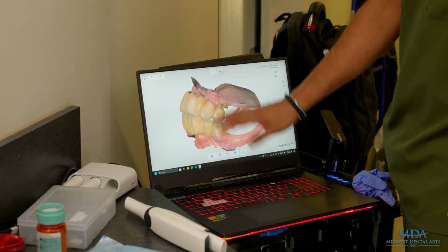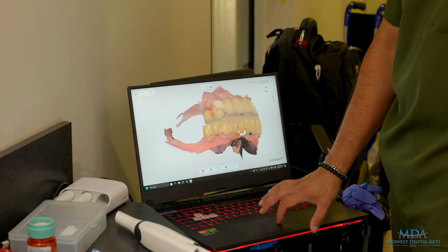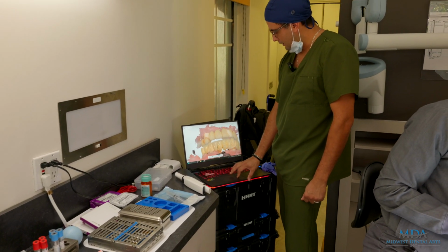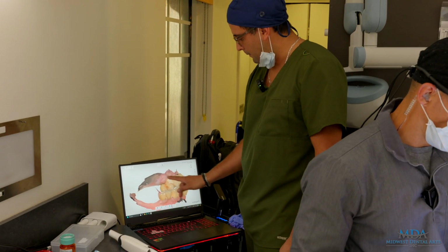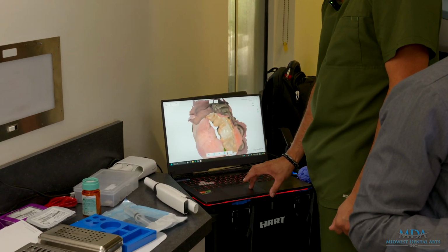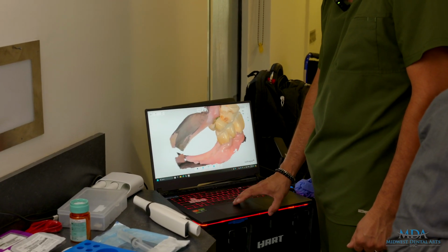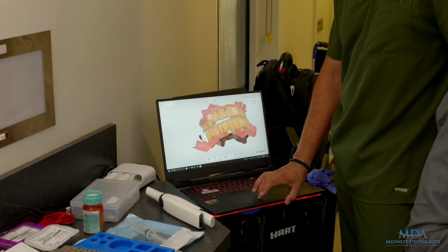And this is the tissue scans that we gathered. The bite, we see that the temp wasn't actually the best here, but it did its job for a really long time. So I think he actually used it up pretty good. But the idea today is to finish up with an all-on-X on the top, in this case, just replacing this with these implants that are already placed. So we're gonna get these out, clean them up nice, change the multi-unit abutments, and then get new scans so that we can move forward.